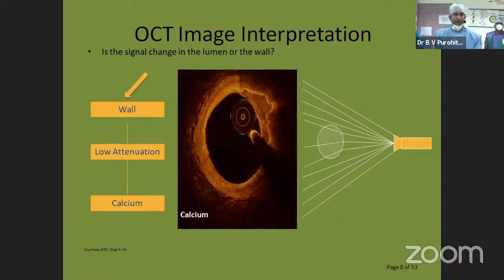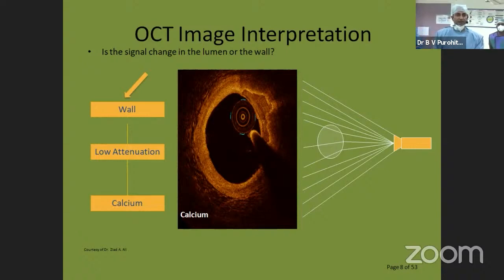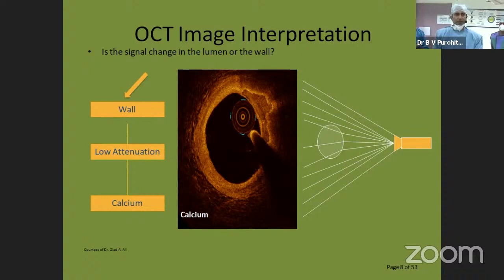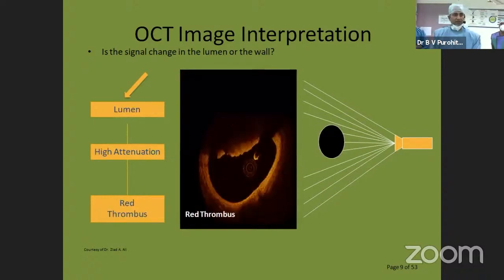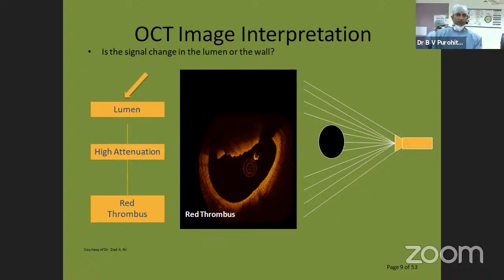A calcific plaque: between 12 o'clock and 3 o'clock you can see an almost map-like pattern — that is dense calcification. This is superficial calcium almost touching the intima, characterized by low attenuation with a very clear, demarcated line. A red thrombus shows high attenuation — you can see something protruding inside the lumen around 9 to 12 o'clock, and you cannot see clearly beyond it.